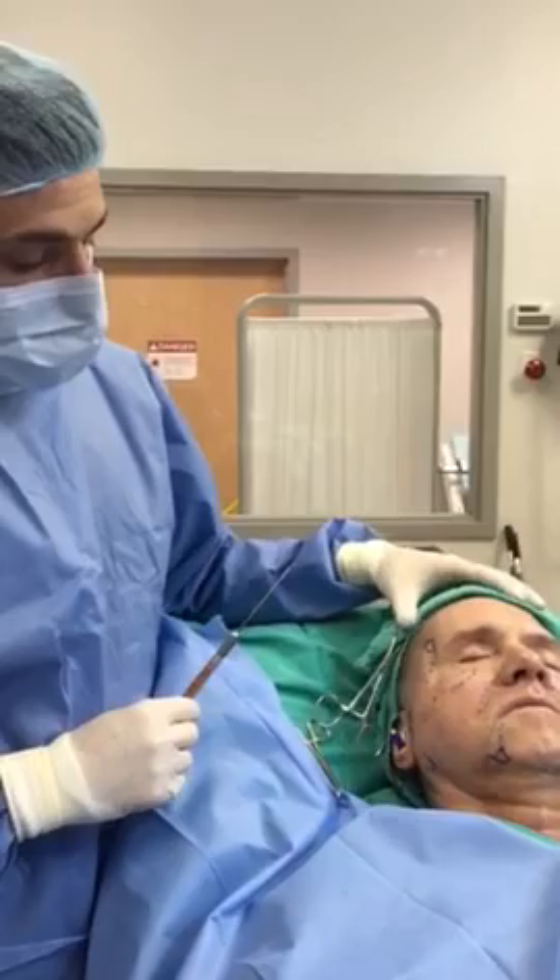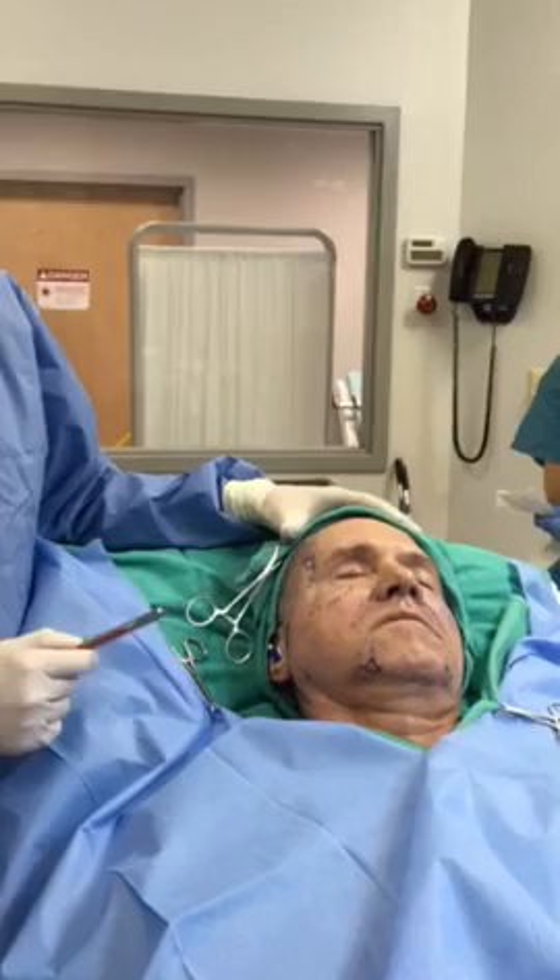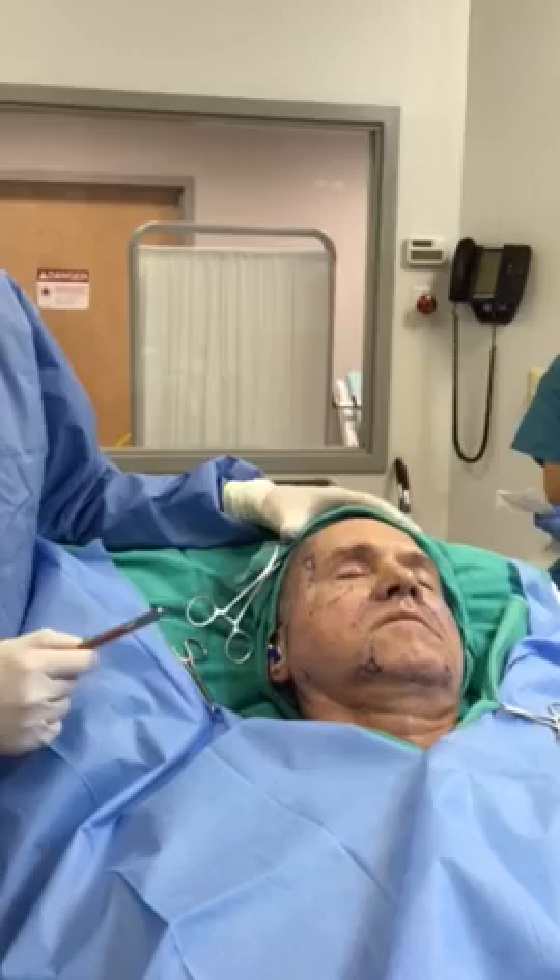So once we have our fat ready and we've prepped the face with our alcohol prep, we're going to go ahead and make a number of passes depositing small amounts of fat underneath the skin to rebuild those areas.